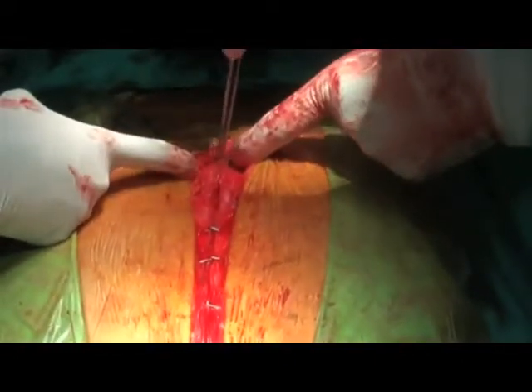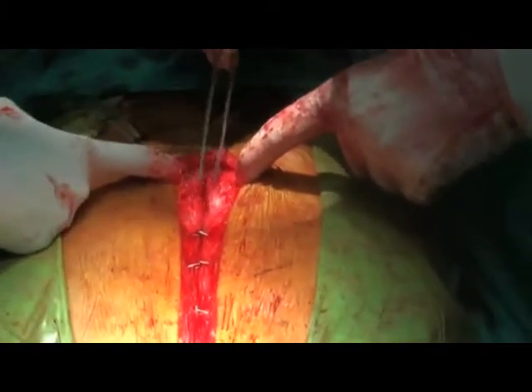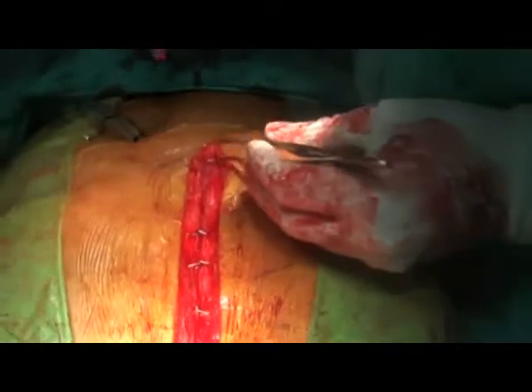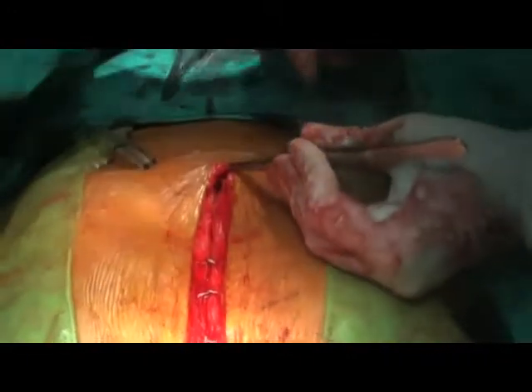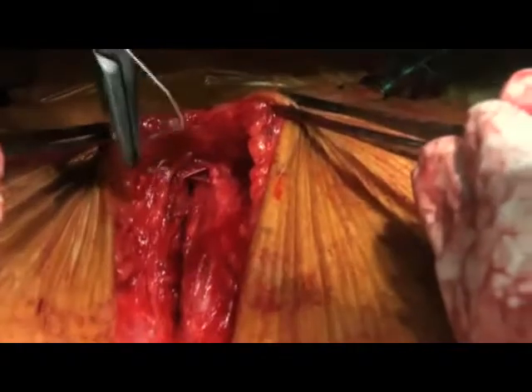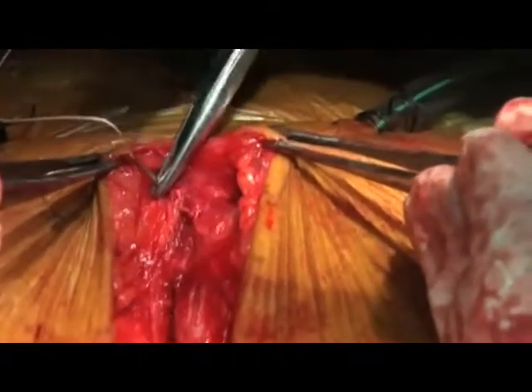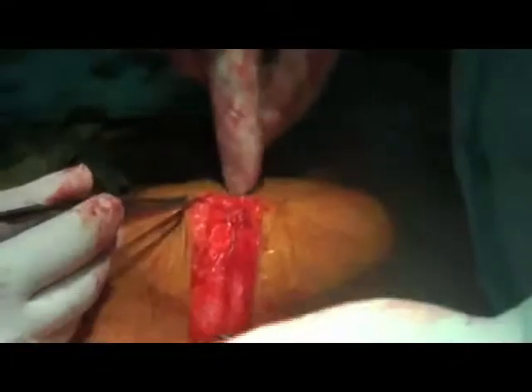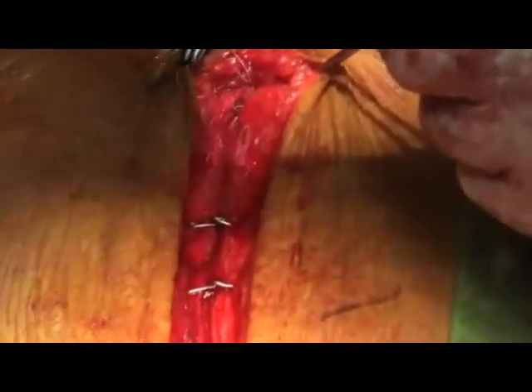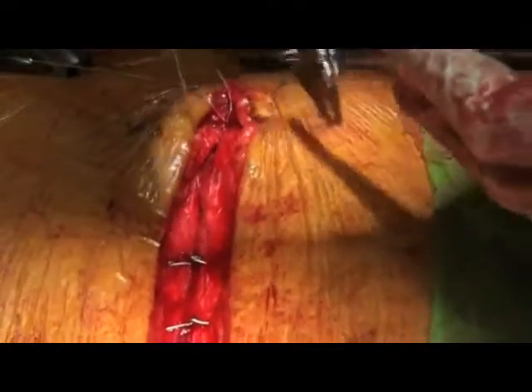An important technical point: many patients will have incisional hernia in the xiphoid region because the rectus sheath and rectus abdominis muscle have been cut in the middle. Filling in this space is very important — otherwise the patient can develop incisional hernia in the long term. One should take the rectus sheath carefully and put sutures only in the sheath, not in the muscle, because muscle under sutures undergoes necrosis and a necrosed muscle is always weak tissue. The rectus sheath is a firm structure that will heal with fibrosis, making the area strong.